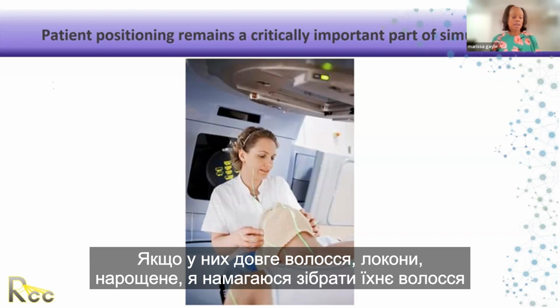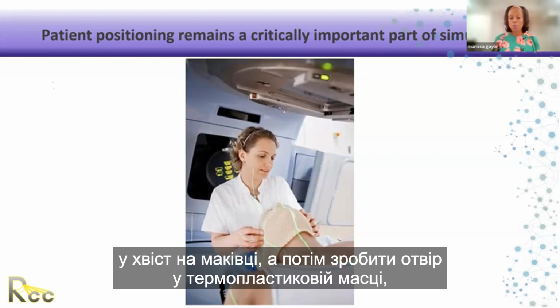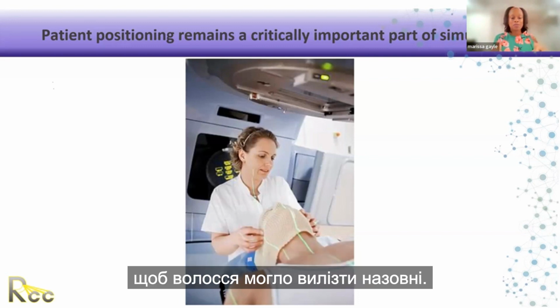If they have long hair, locks, extensions, I try to pull their hair into a ponytail at the top and then make a hole in the thermoplastic mask so the hair can fall through. That will add to the reproducibility of the setup.